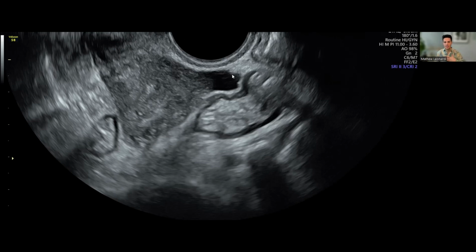And when I do the scan myself, this is a scan that I've actually performed myself. I'm in real time interpreting the things that I'm seeing or not seeing. And so I do my best to capture good pictures, but sometimes I'm not very comprehensive in capturing every segment. But if you're trying to show pictures to another person, you should try and capture as much as possible.